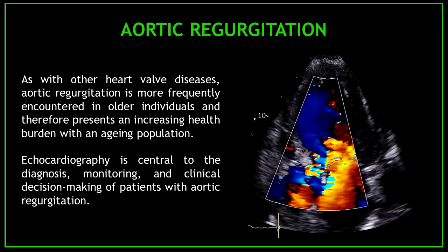As with other heart valve diseases, aortic regurgitation is more frequently encountered in older individuals and therefore presents an increasing health burden with an aging population. Echocardiography is central to the diagnosis, monitoring, and clinical decision-making of patients with aortic regurgitation.